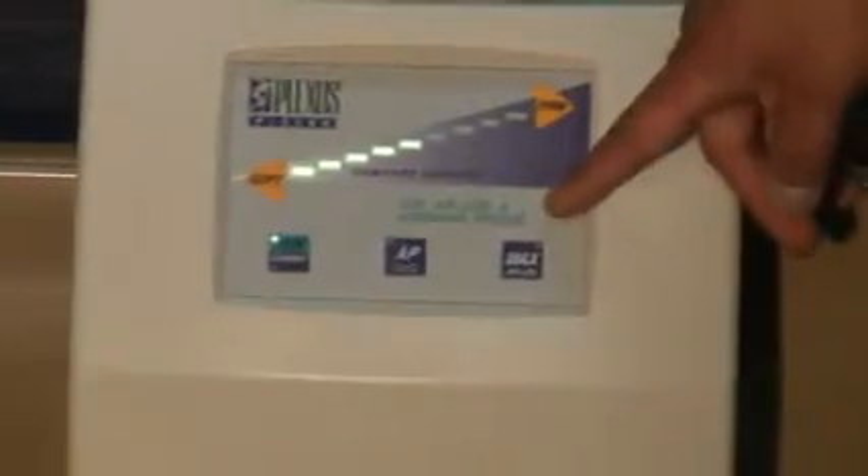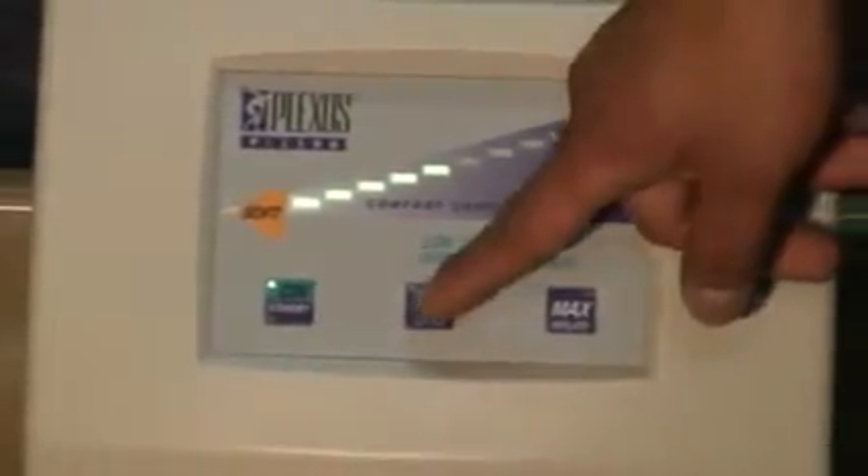The Plexus 2500 low air loss and alternating pressure mattress is always on low air loss therapy. If you wish to utilize alternating pressure therapy, you will need to activate your AP by pressing your AP button. When you press your AP button, you will see a green light notifying the user that the AP function has been activated. This will cause your low air loss mattress to also be alternating pressure, working in five-minute time cycles.